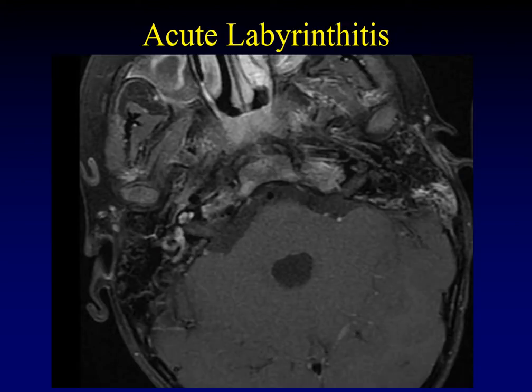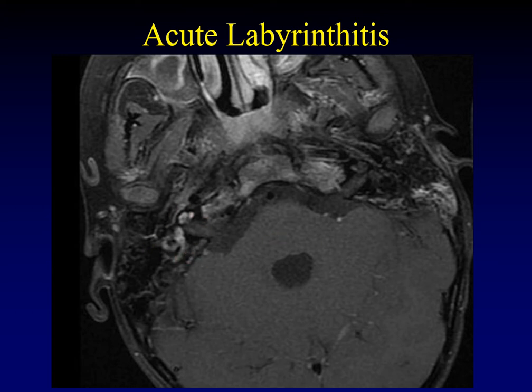Here's an example of labyrinthitis ossificans in its acute phase. You can see abnormal enhancement on this T1-weighted image all through the cochlea, all through the labyrinth, and all through the semicircular canals. This is the earliest stage of the disease, and this is the only sequence on which you'll have findings.